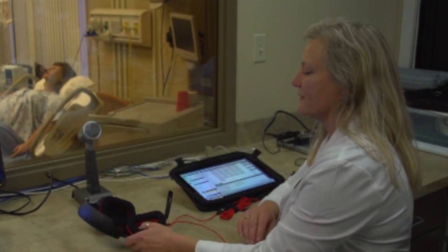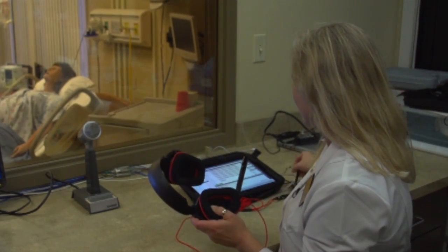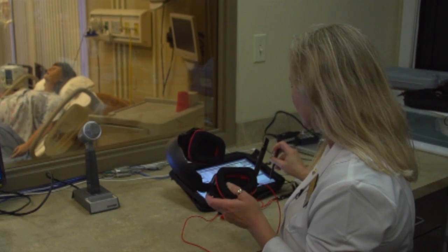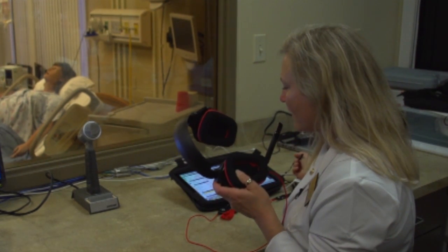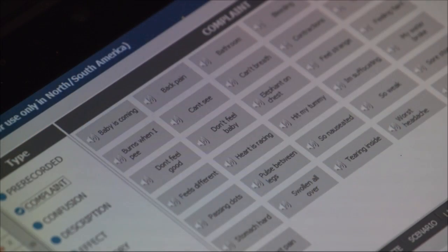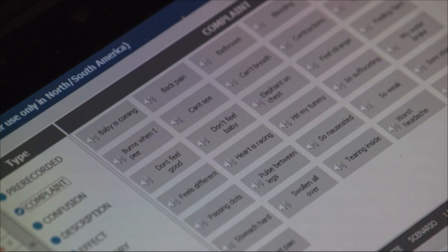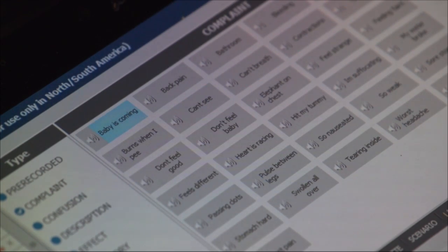This is the voice of the patient. At any time I could be — hi, I'm not feeling so well. There is also an option where we can go into a pre-recorded area — the baby's coming.